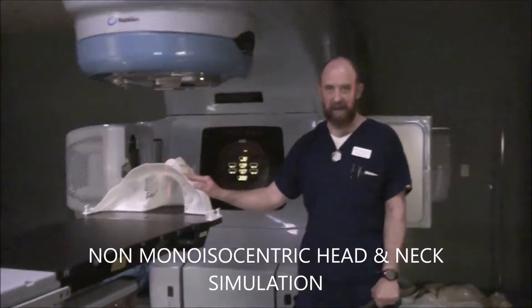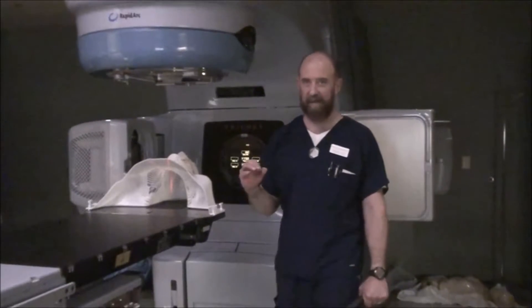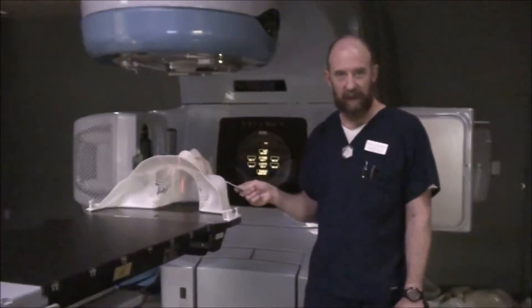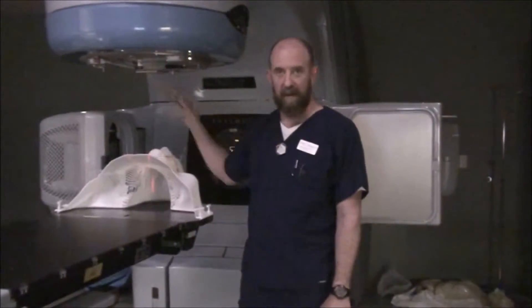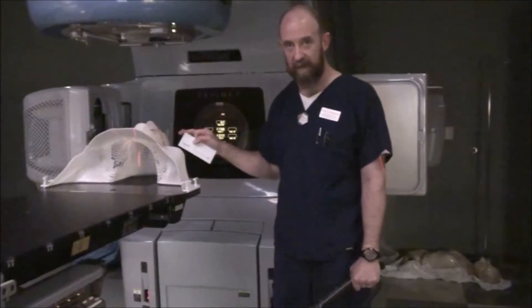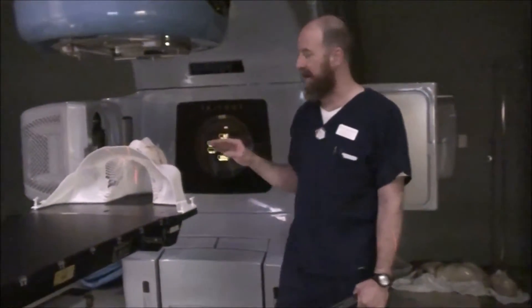Non-monoisocentric head and neck is going to be very similar, just like in our notes. There are italicized versions of the extra things you have to do. A non-mono-iso superclavicular field will have some way of actually blocking the superior edge of the field that you would normally just close down with a jaw. We're going to leave the field size open to indicate that it is open and we have divergence everywhere. What you have to do is exactly like we did on the monoisocentric.